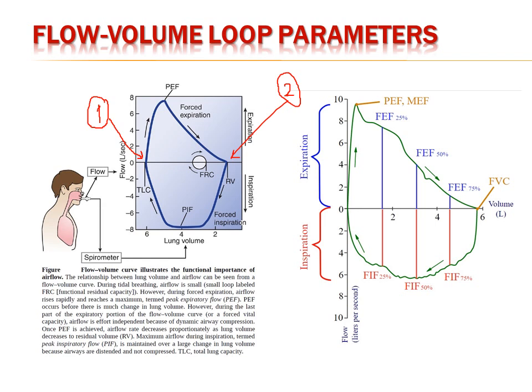That's why the peak will be pointed in expiration. The reverse will happen during inspiration. Inspiration will be easy, because when we expand the lung, the diameter of the bronchioles will increase and the resistance will be lowered. So the area under the curve is wider during inspiration.